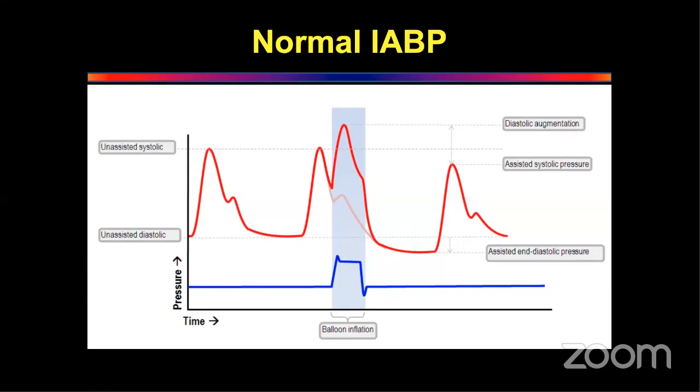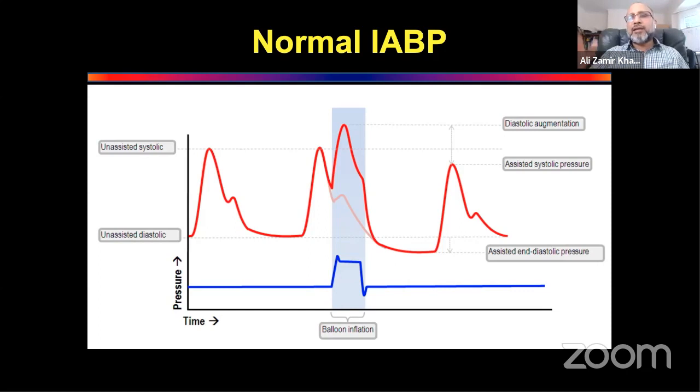Never one tracing. You have to draw the second and the third tracing also. That is a normal balloon pump tracing, not just the one tracing. If you draw just one cycle with one little augmentation, that's not good enough, because that's not telling me that you've understood the real benefit of a balloon pump.